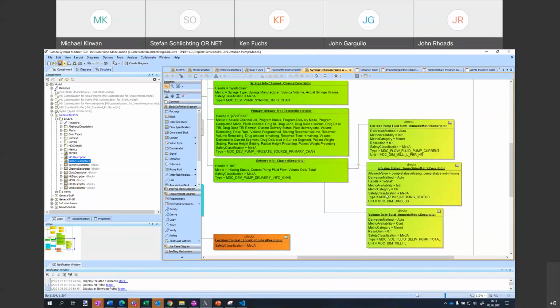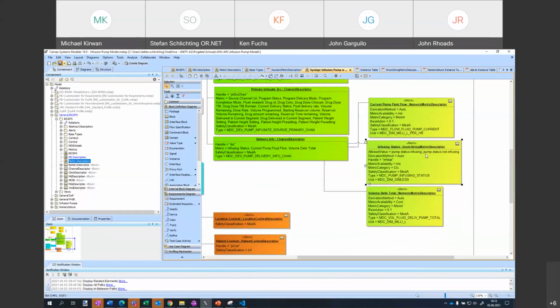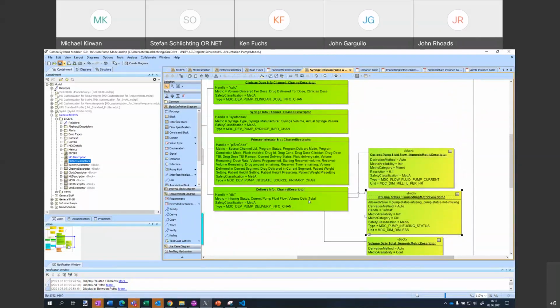It's also the same for the infusion status, and there, of course, it's an enum string metric, and it has these two allowed values modeled. It also has a type and a unit. It should have the setting somewhere, which I obviously didn't set, or which I removed from display. Oh, I can directly fix it. Metric category. Oh, no, it's set to calculation. Oh, yeah, because it's not a setting. And it has a volume of delivery total. So these are examples of some of the measurements, and we have them for way more.